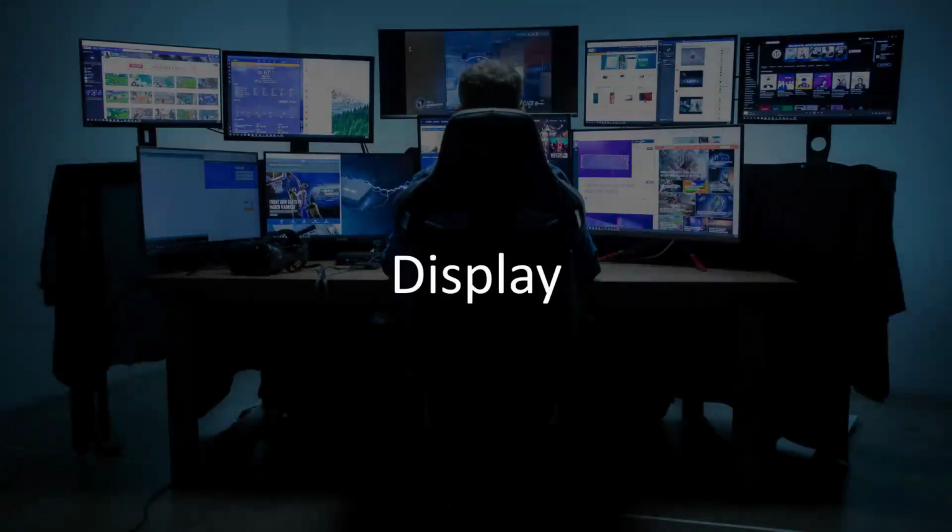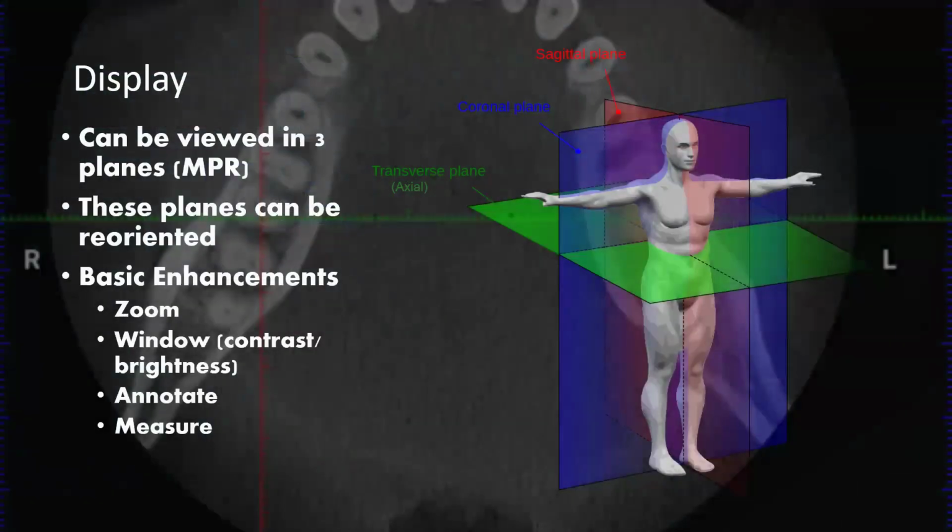Talk a little bit about the display. My home setup doesn't quite look this nice. Maybe I'll get there. But I mentioned a good thing about ours is we can change the field of view. We can change the orientation. We can change that on the fly.